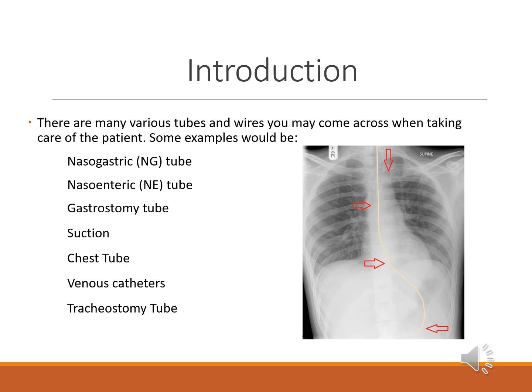Sometimes patients might have a gastrostomy tube, which is used for those who are very weak and cannot eat normally. These patients require careful and sensitive handling. In some cases, a patient who has vomited or has fluids in their mouth or throat may need suctioning while under the care of a technologist. While the technologist doesn't perform the suctioning, they must quickly assess the patient to ensure the procedure is done promptly to avoid fluid entering the lungs, resulting in breathing problems as well as aspiration.